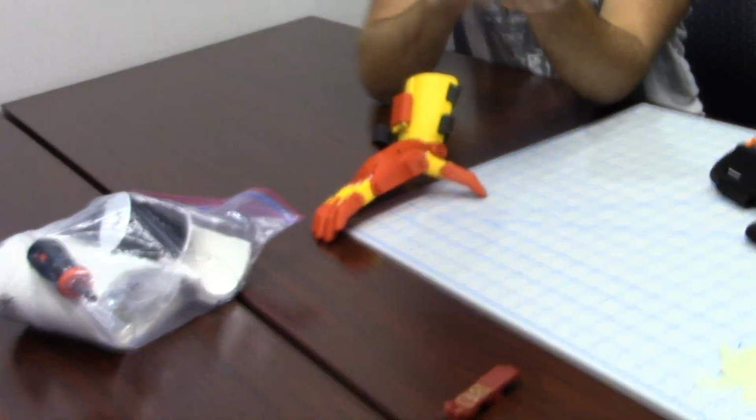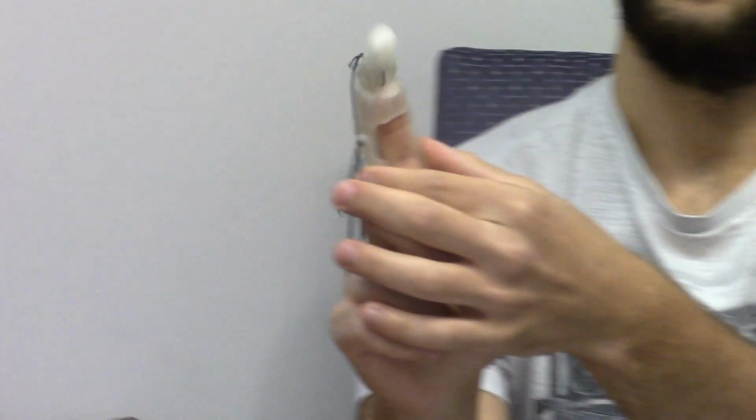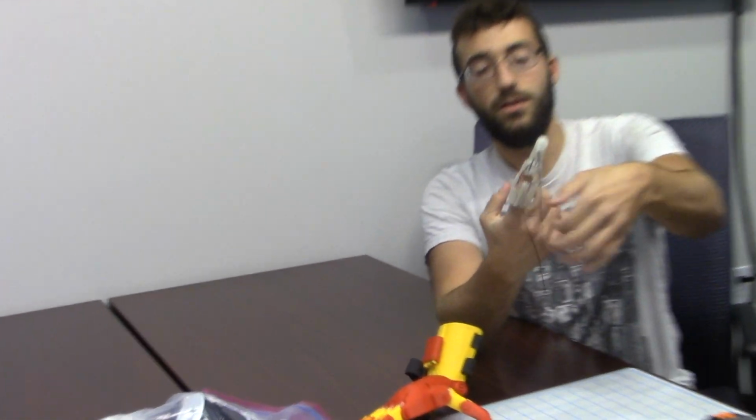Over here we have a prototype finger that we made for one of our professors, Dr. Keller. Maybe you know him, maybe you don't. Basically, it's supposed to flex and bend, and it's supposed to go on to his middle finger, and that way he can actually have another finger there. It's invisible. Here are some of the strings, various ones. This one's elastic. It allows for that fingertip to flex, and we have pins in here that allow it to bend. Everything we have done so far has been troubleshooting and critical thinking and everything like that. One step at a time.